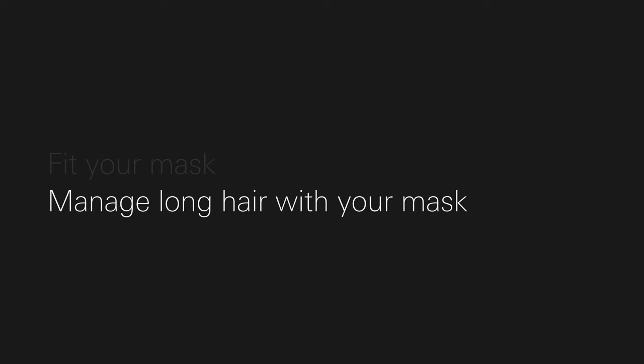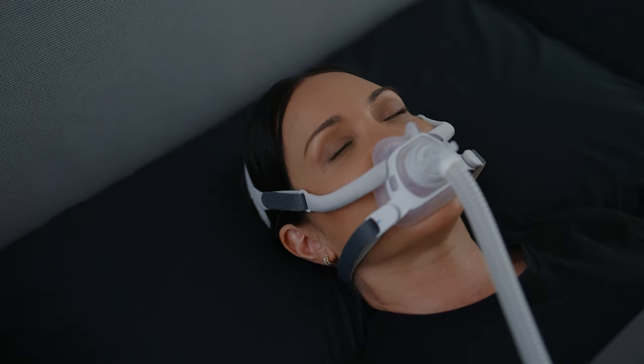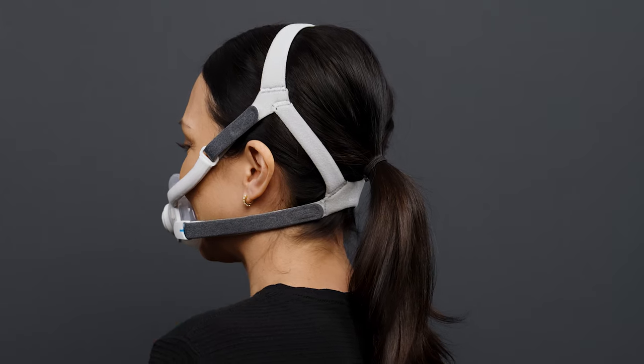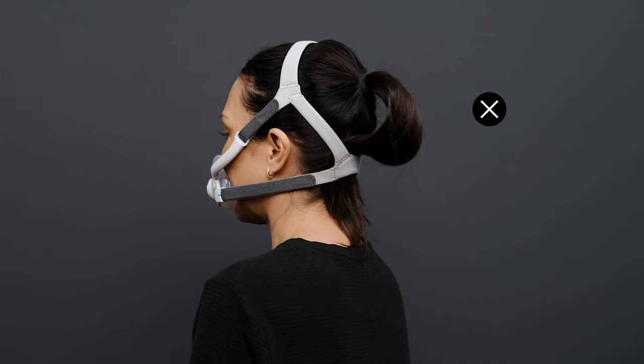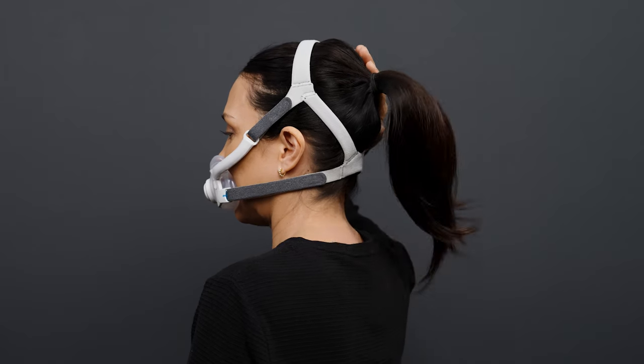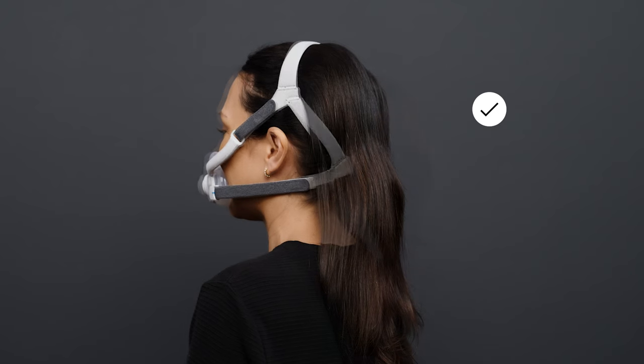Manage long hair with your mask. In this video, we'll show you an option of how to fit your AirFit F40 if you have long hair. If you have long hair, make sure your hair is on the outside of the headgear for the best fit. Having your hair underneath the headgear can lead to a less secure fit. Once your hair is over the top of the headgear, wear your hair as you prefer.